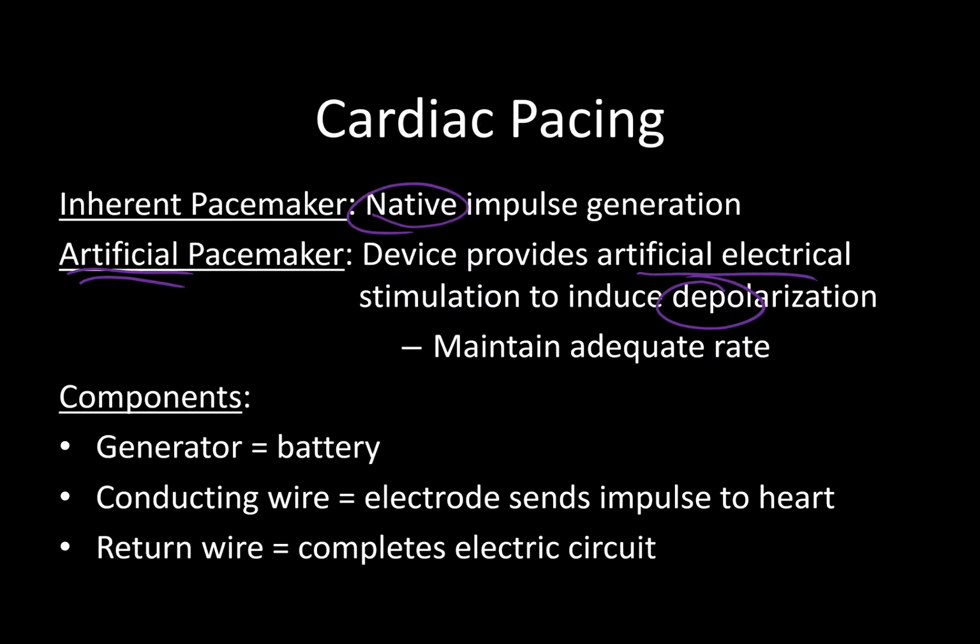The goal of all of this is to maintain an adequate heart rate. And in fact, that's the indication for placing a pacemaker pretty much all the time, almost.